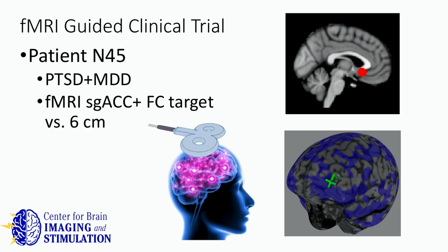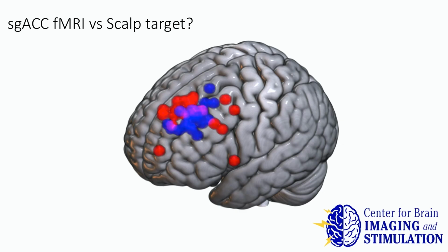All right, so in order to justify the hassle and the expense of image-guided targeting, we have to show in head-to-head comparisons that the way they do it in the clinic with something that's a lot less personalized is not as effective. So that's an important avenue that a number of us are working towards.